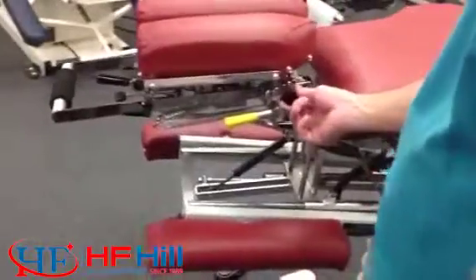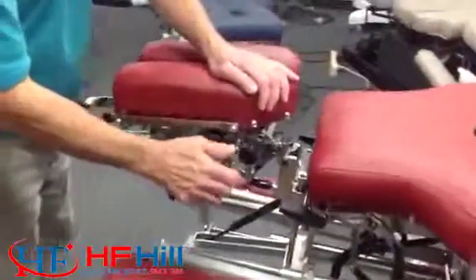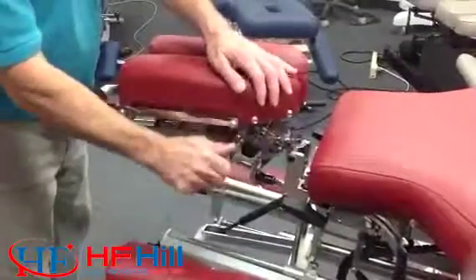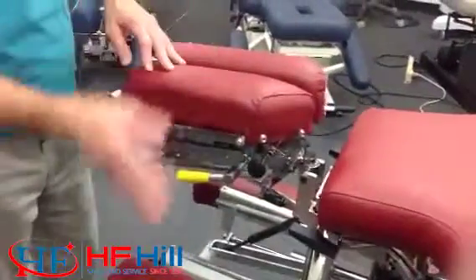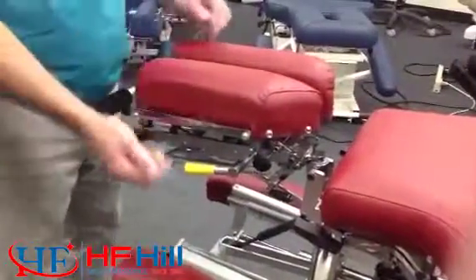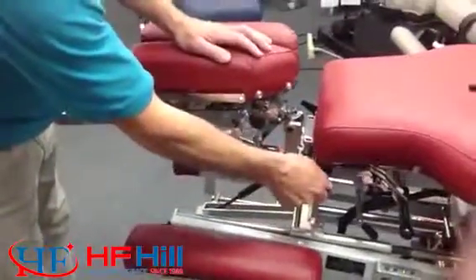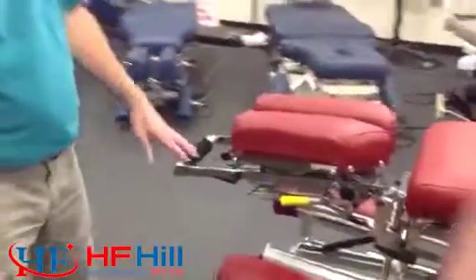On this side over here, this is your tension for your drops. As we did our drops right here, and we do a righty-tighty, you get more tension, and a lefty-loosey, you get less tension. So there's your tension mechanism. That particular knob is only on the right side as you stand in front of the table, and you have the same cocking knobs on both sides and the same elevation knobs on both sides. All right, so that is your total dimension flexion headpiece from Lloyd Table Company.